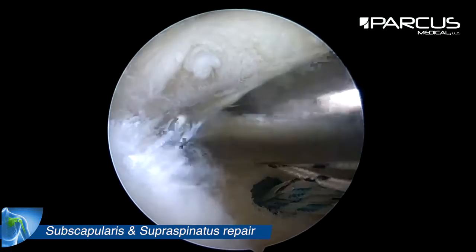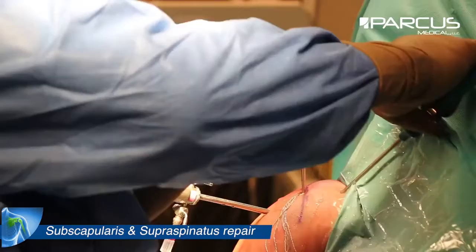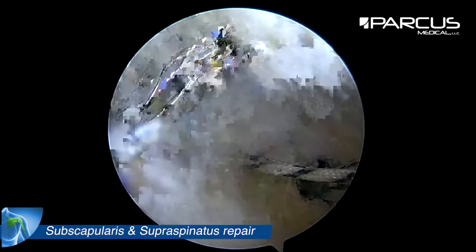This tear is a posterior L-shaped tear and we need to check the reduction of the tear, so we pass a suture through the posterior edge of the supraspinatus and the anterior edge of the infraspinatus.